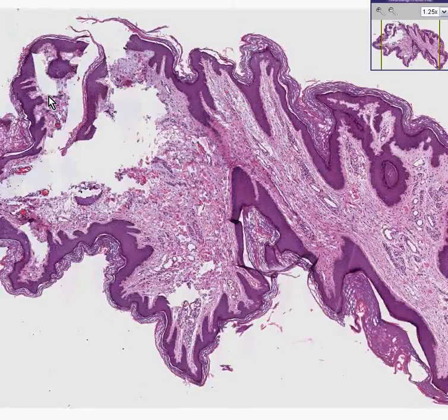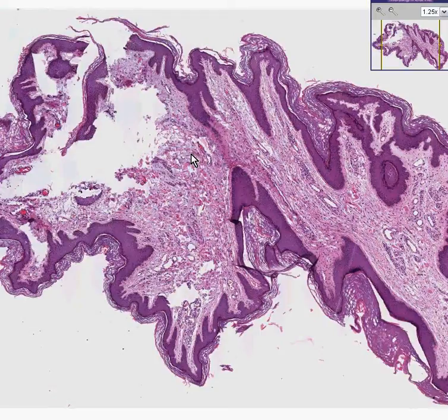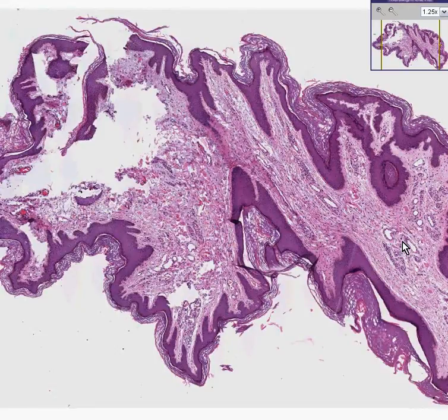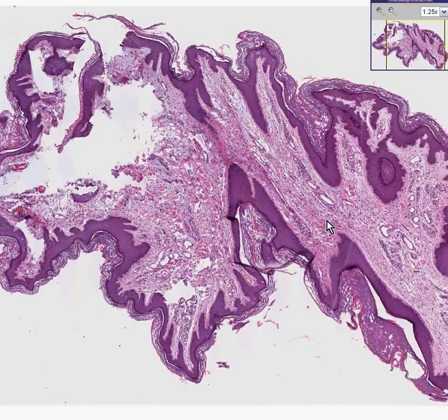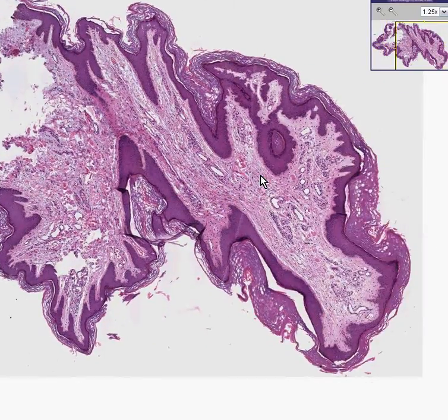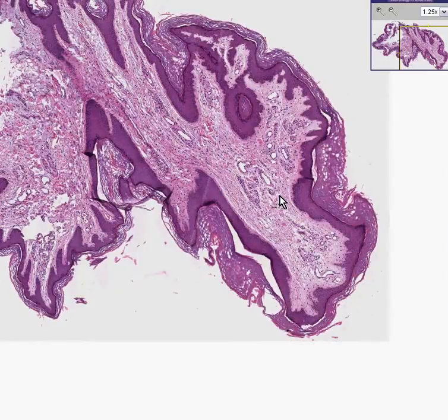Just as we saw in the previous case, in an epidermal inclusion cyst the epithelium turns inward to form a cyst. Here is a common condition in which the epithelium grows outward like a papilla with a fibrovascular core, which is what the definition of a papilla is — a fibroepithelial finger with a connective tissue core lined by epithelium. This is a fibroepithelial polyp.